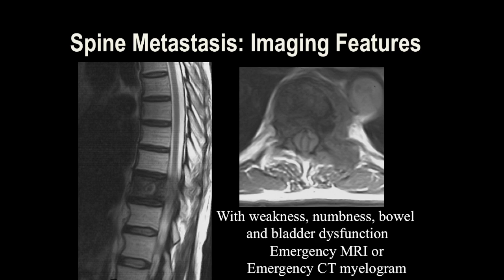When there is severe metastatic involvement of a level, the patient can develop neurological symptoms. In that case, MRI is considered a cord compression MRI and is an emergency — you want to identify the level and refer the patient to neurosurgery in case they are a candidate for decompression.